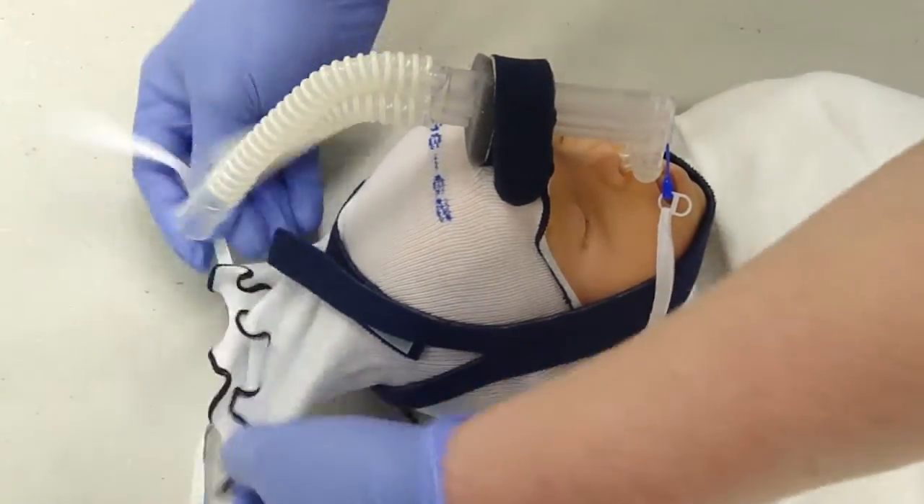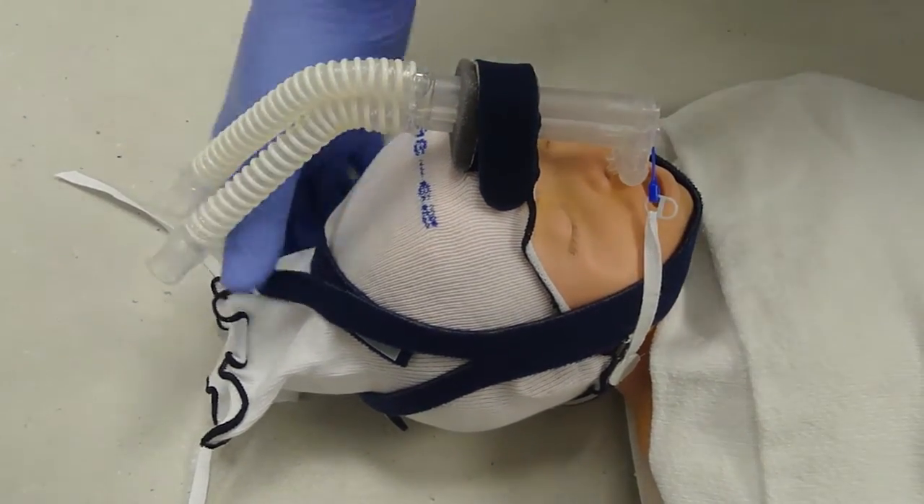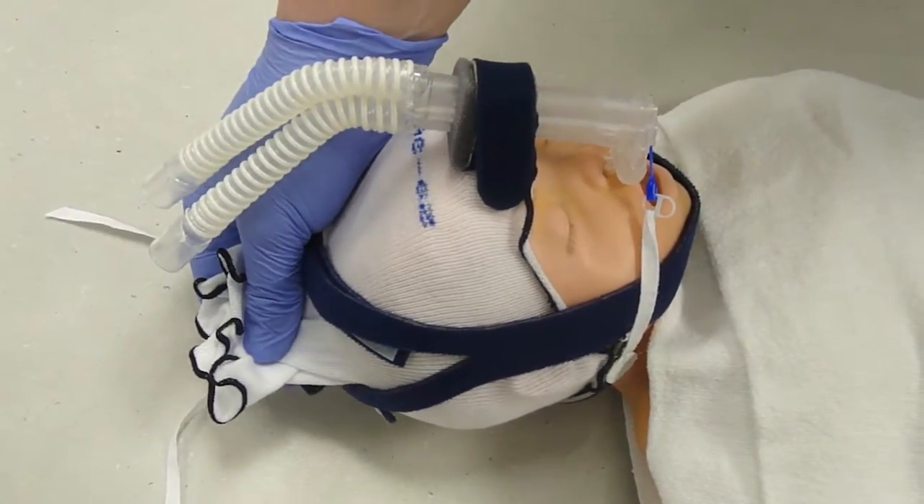Also note that the top of the hat is left untied. Sometimes if you tie the hat, it tends to pull the bonnet up and you have more trouble with positioning.